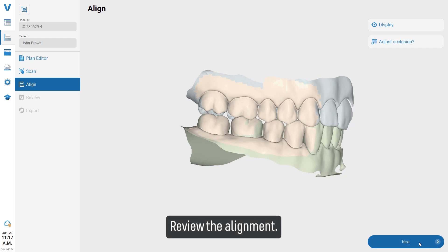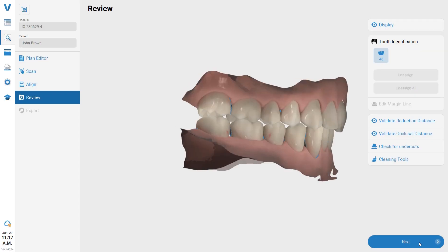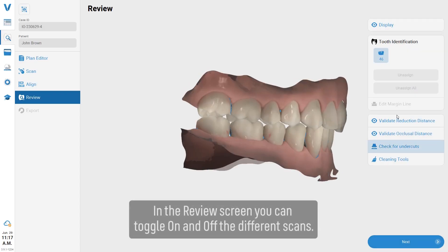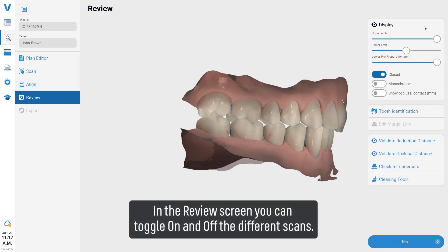Review the alignment. In the review screen, you can toggle on and off the different scans.